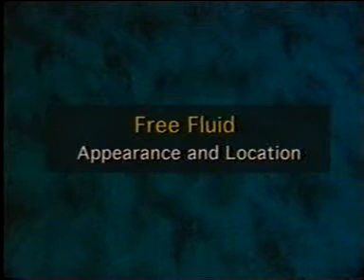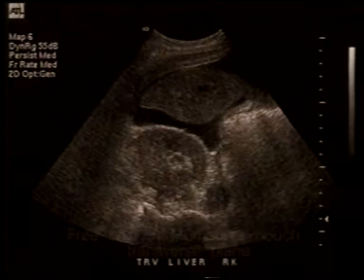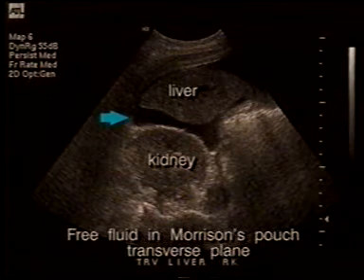Free fluid appears as a black space that you see between the liver and right kidney, around the spleen, and down in the pelvis. Free fluid is most likely found in what is called Morrison's pouch, between the liver and the right kidney. Morrison's pouch.